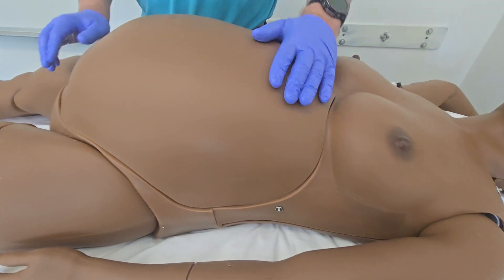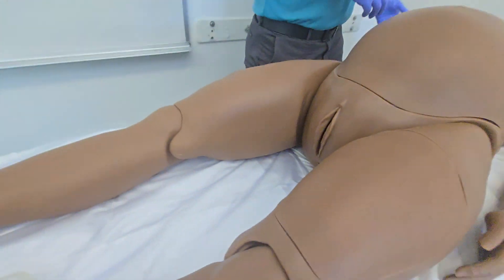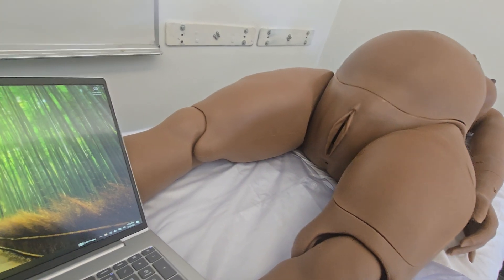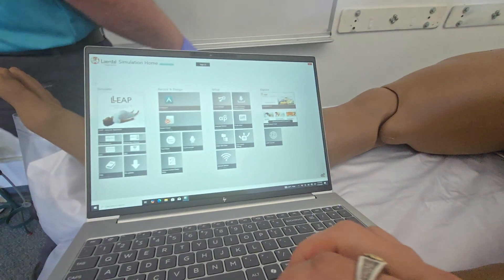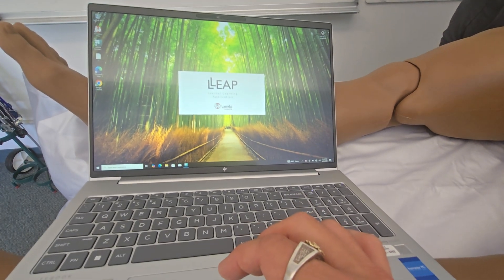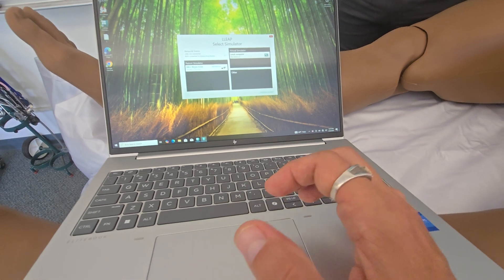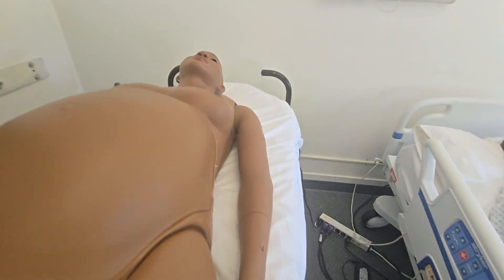Put the belly module back on — there we go. We'll turn the mannequin back on and go to Leap Simulation Home. That call is letting you know she's powered on and able to connect to her application in the upper left-hand corner. When this first loads up it's going to ask us to connect to the mannequin. I renamed your mannequin Santa Barbara City College Mom Anne, so go ahead and click on that. If it makes noises, that's okay — that's just the system initializing.